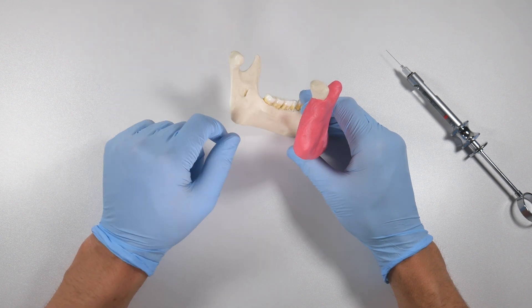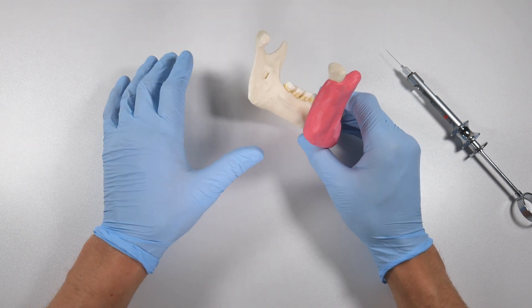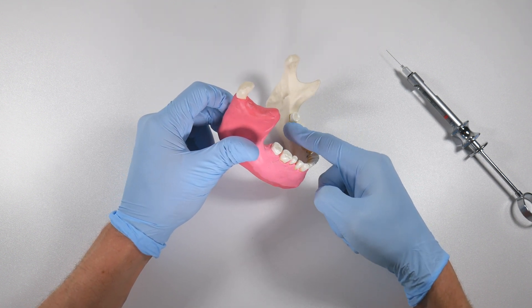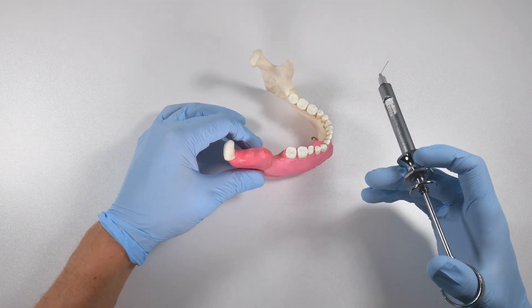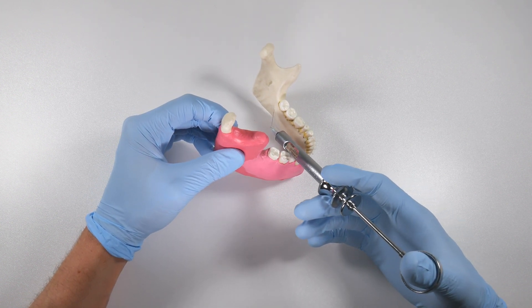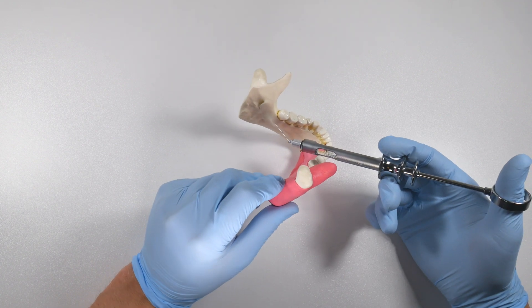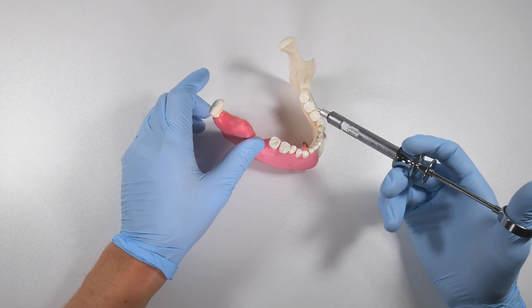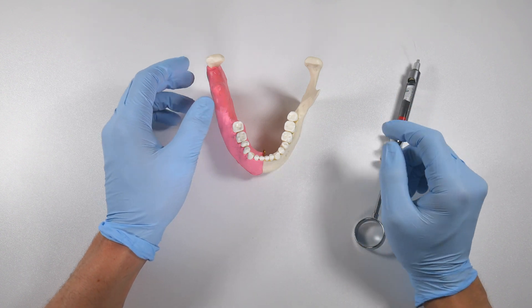What better chance would you have to get this tooth numb than to deposit your anesthesia right here? You might say the lingual nerve is there, and you'd be right — it runs along the lingual of these teeth, but it's generally higher up as it passes back and drops lower coming anteriorly. So most times injecting in this area, you're in the safe zone. Make sure you have good visibility and access. I'll often put a bit of a bend in the needle, which allows you to get under the tongue and deposit your anesthetic right down in here. Put in about half a carpule, let it sit, and you'll be amazed at how often that helps get the tooth much more comfortable — often enough to continue the procedure and get it out with no problems.